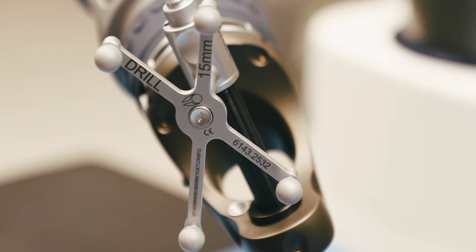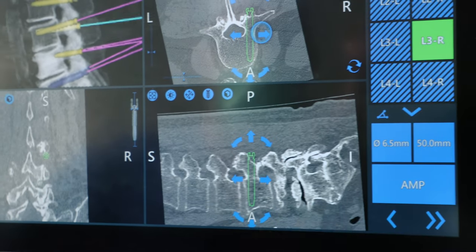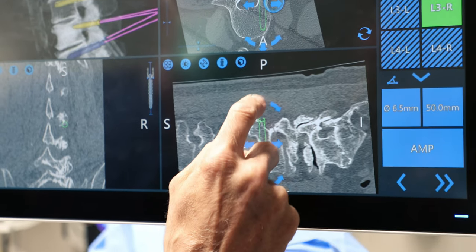So I do all that preoperatively. I take your x-rays, I take measurements using surgery maps to determine what position is the best position for you, and then look at the preoperative CT scan and make the plan of where each screw goes. At that point, I know the robot is going to be precise.